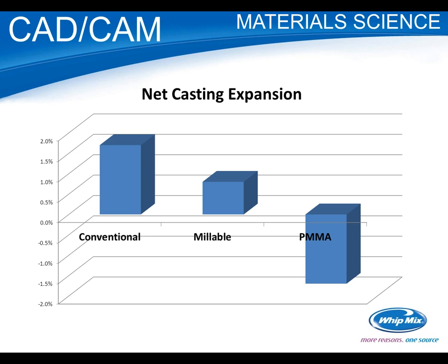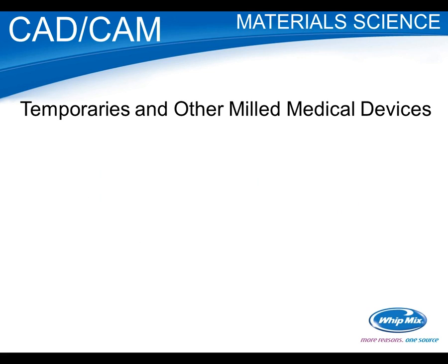I don't know why. But what we found we could do is, since we were making the patterns by CAD/CAM, we could actually dial in a correction factor like you do on the zirconia. You put in that shrinkage, and we could get great fit. So that's an option if you're using PMMA or really any of these other materials, and you're not getting your fit. You've got that correction factor like you do for zirconia that you can compensate. So something to be aware of.